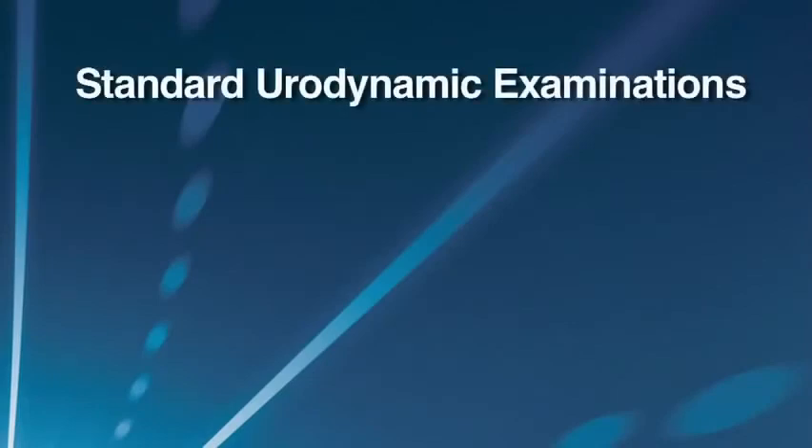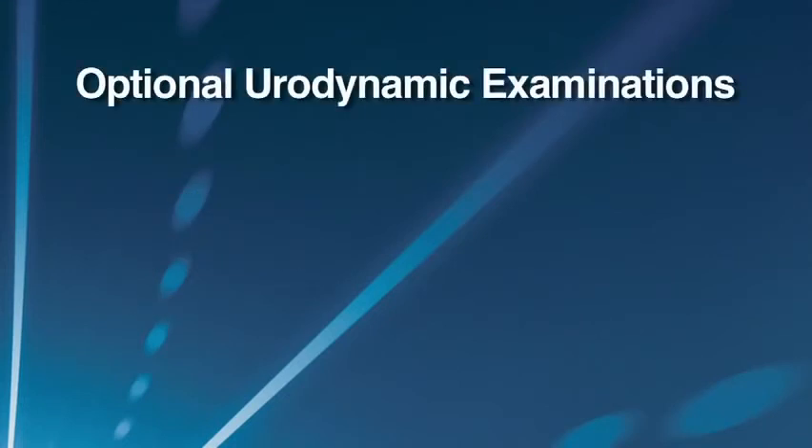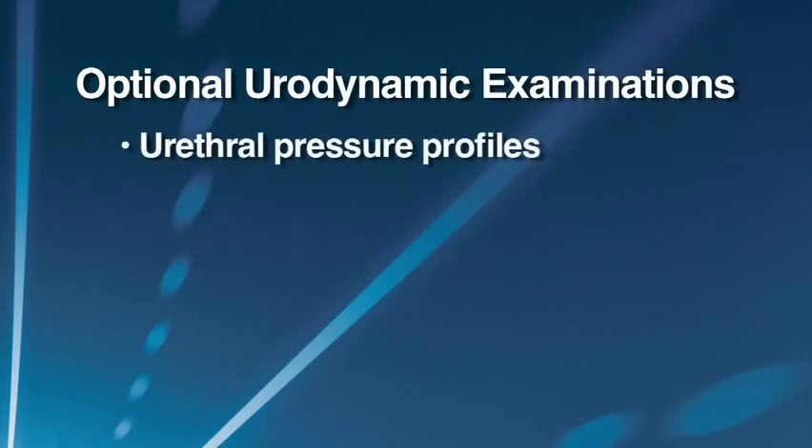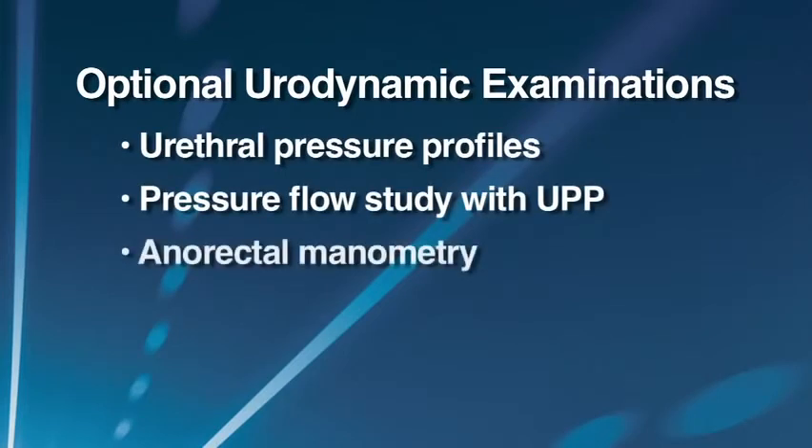The SolarBlue has been designed to carry out routine urodynamics quickly, easily, and conveniently. Each SolarBlue comes standard to perform uroflometry, cystometry, pressure flow, and EMG studies. In addition, optional studies include urethral pressure profiles, pressure flow study with UPP, anorectal manometry, as well as biofeedback.